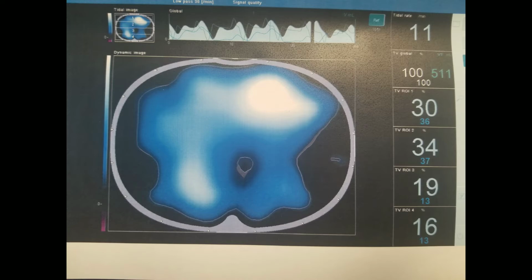Because recruitment is pressure over time, when you're using APRV, you can increase the time, and very often you require less pressure. So this is a good option if ever you see that there's regions that are not ventilated. It's always worth doing a run of APRV to see, because as you know, with the higher PEEPs, we were causing over distension, and that wasn't the case with APRV.